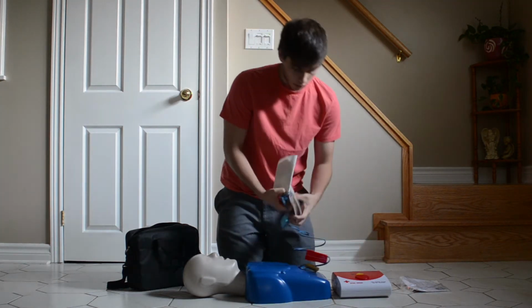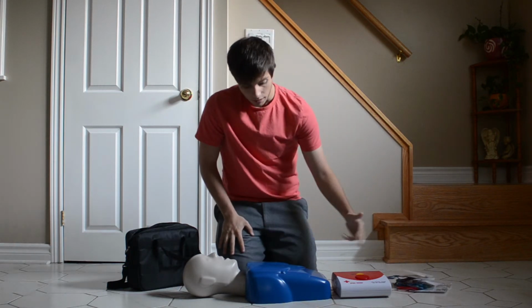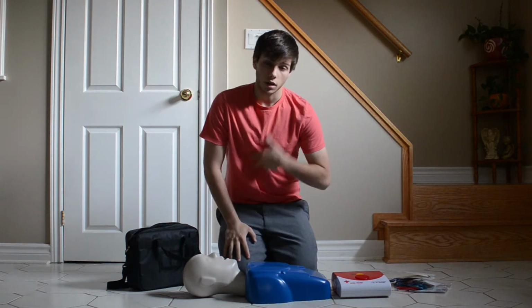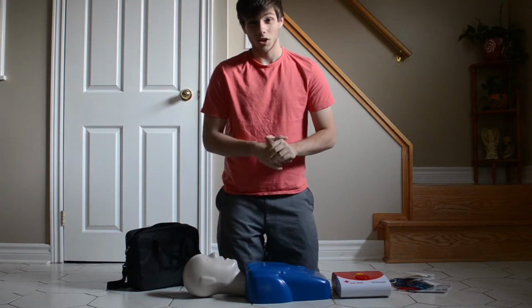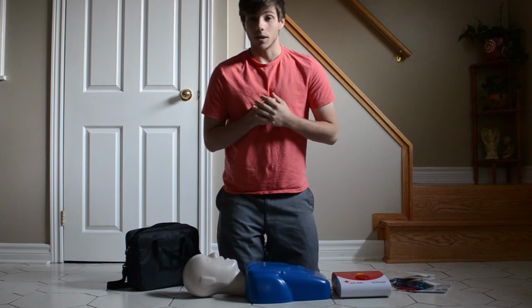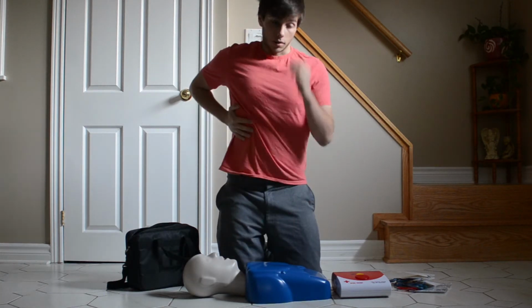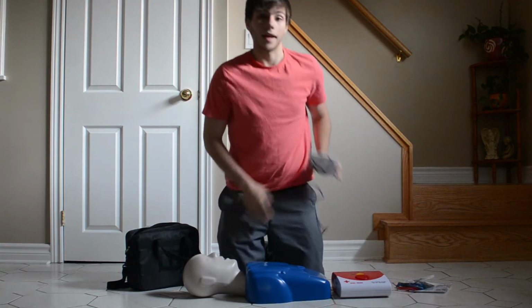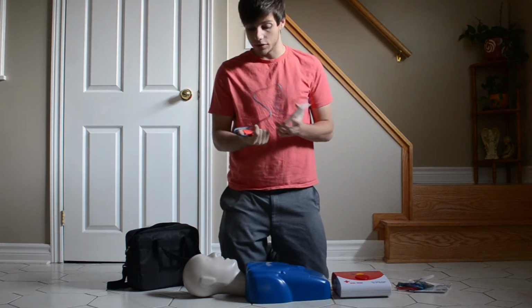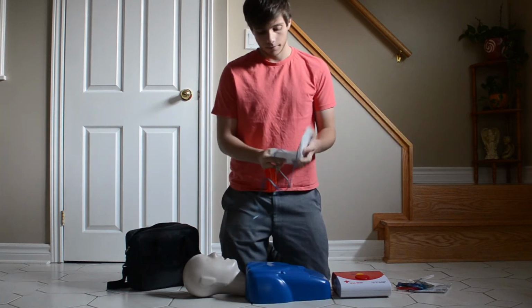The first thing you want to do when you get a kit is use the scissors. You want to cut the shirt off the person, going along the seam right down the chest, so it's out of your way. Next, make sure there's no jewelry or anything metallic that's going to be in the path of the current, which goes from the shoulder to below the ribs. Placement is indicated on the pads, and the AED talks to you the whole way. So if there's any part of this that you forget, the AED will run you through it.